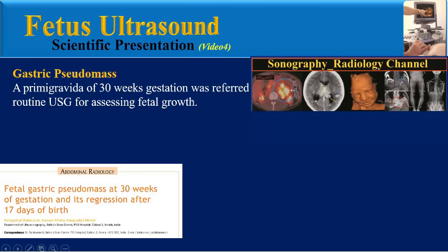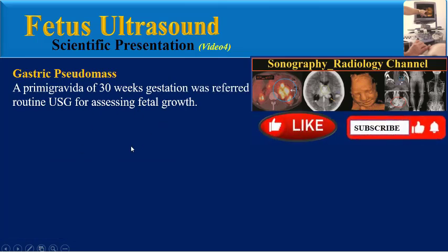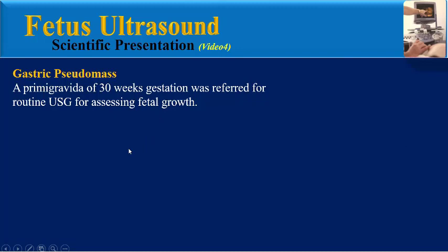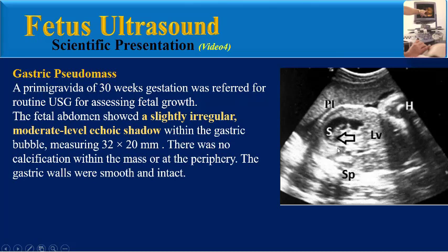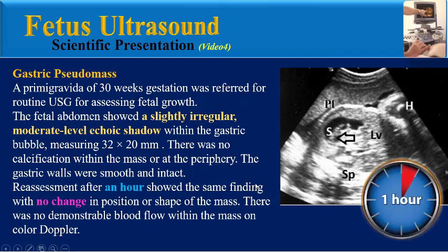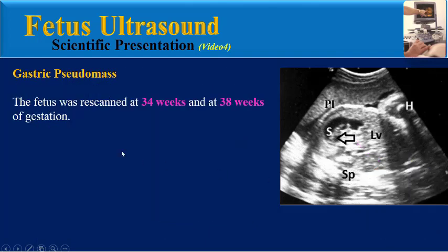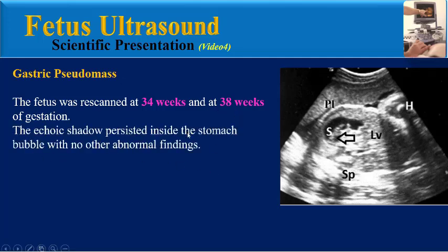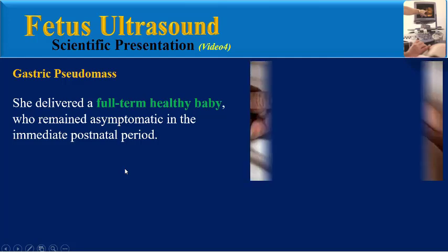A second teaching case: a primigravida of 30 weeks gestation was referred for routine ultrasound for assessing fetal growth. The fetal abdomen showed a slightly irregular moderate echoic shadow within the gastric bubble. There was no calcification within the mass or at the periphery. The gastric walls were smooth and intact. Re-assessment after one hour showed the same finding with no change in position or shape of the mass. There was no demonstrable blood flow on color Doppler ultrasound. The fetus was re-scanned at 34 and 38 weeks of gestation, and the echoic shadow persisted inside the stomach bubble with no other abnormal findings.